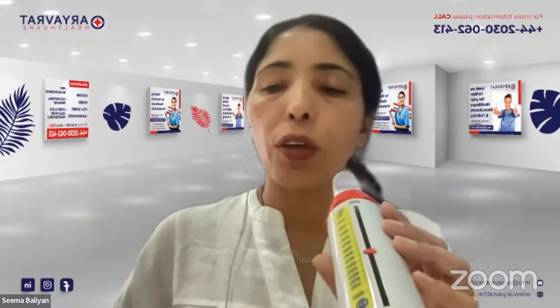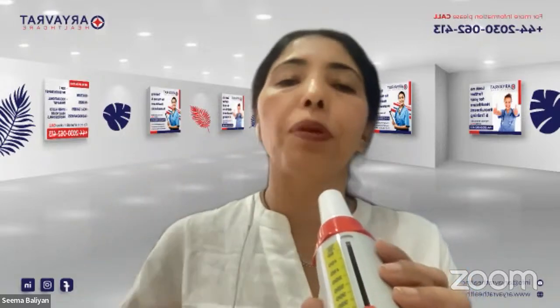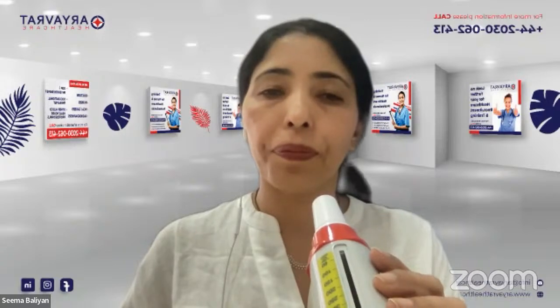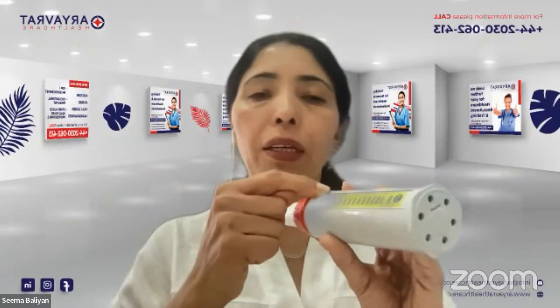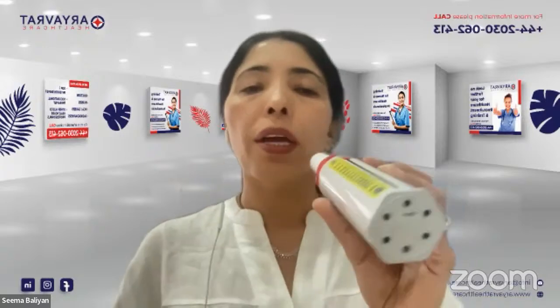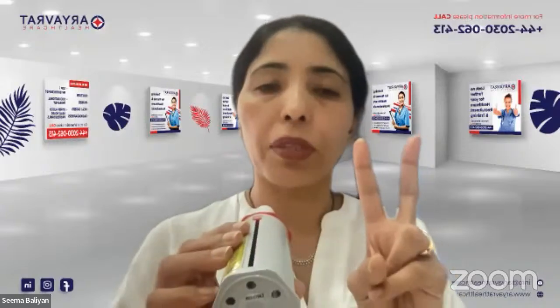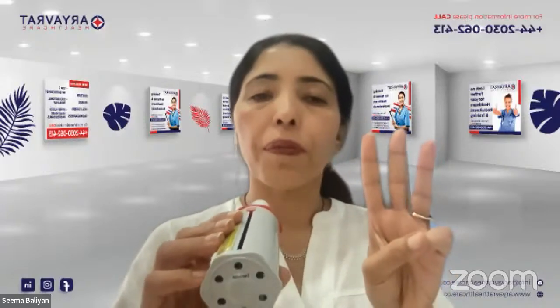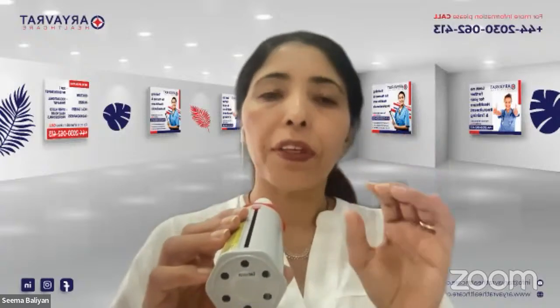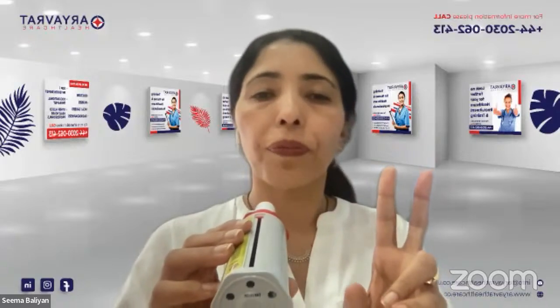So once you get your first reading, you make a note of that reading on a piece of paper that will be provided to you in the exam. After that, you bring the plunger back to 0, and you will tell the patient that we are now going to repeat it 2 more times. So in total, you will need to do it 3 times, unless the difference between any 2 readings is more than 40 units.